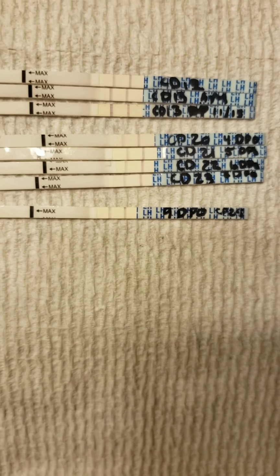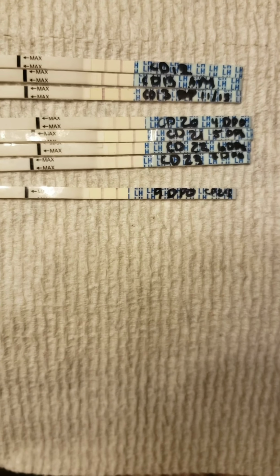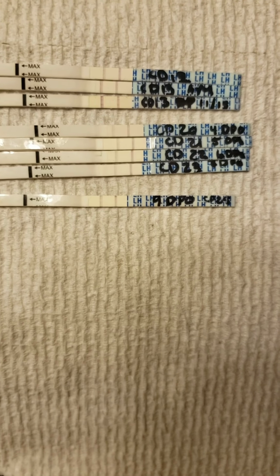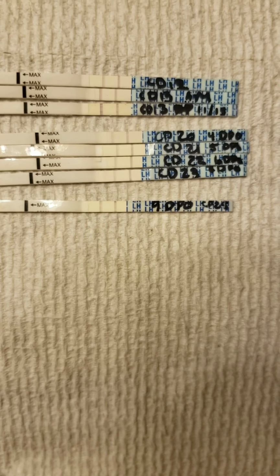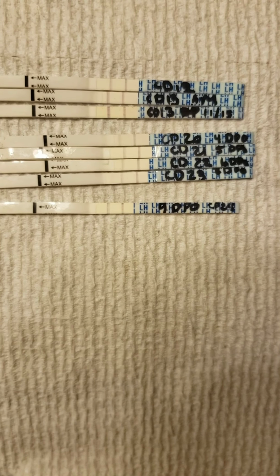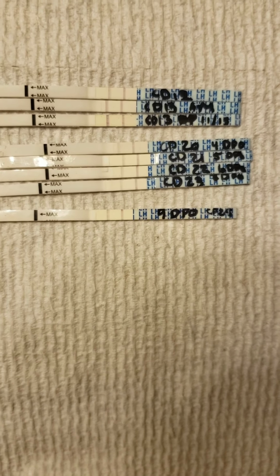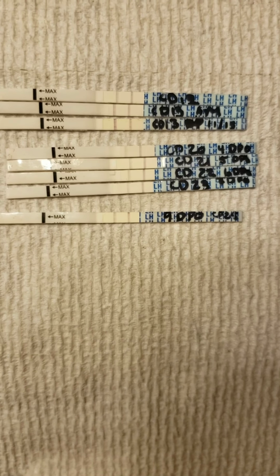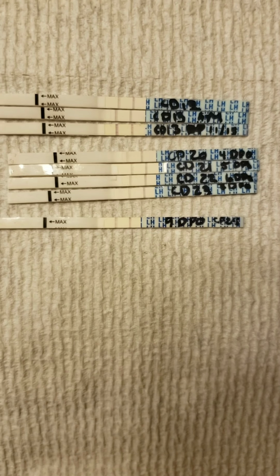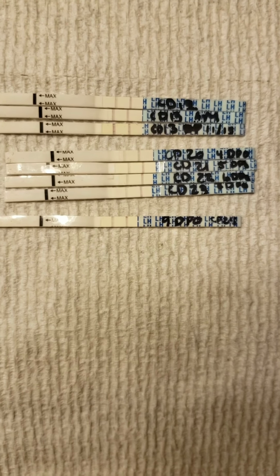All right, so you can see at CD 12, the first day I took it, I actually was getting close to ovulation. And then CD 13 is the day that I was supposed to fly out. So I took 3 tests that day. The third one is not depicted, but I took one early in the morning and I was like, oh my gosh, I think that's a positive. Well, it's technically a positive. And then I took one right before I was about to leave, and it was definitely positive. I was like, just hold out, please don't peak. And then when I got there, I took one and I peaked. So yeah, we definitely had sex, aka baby danced.